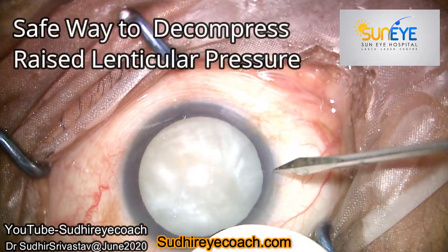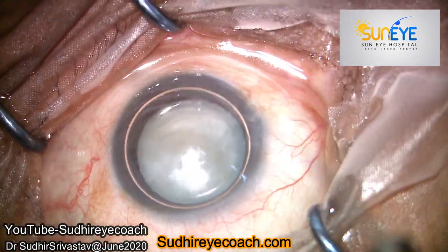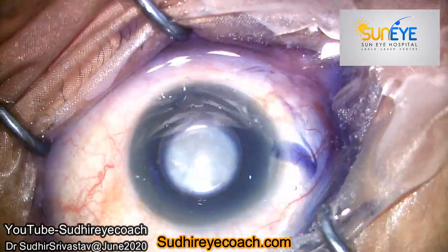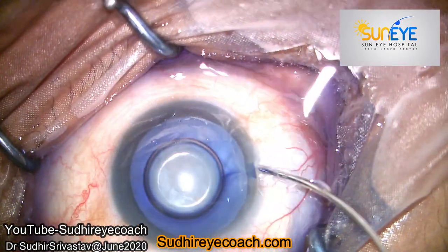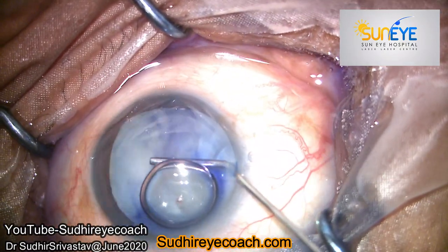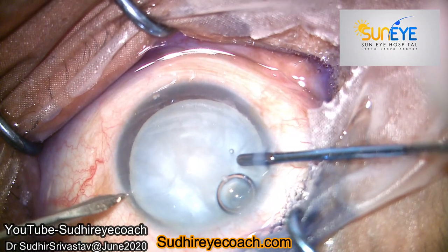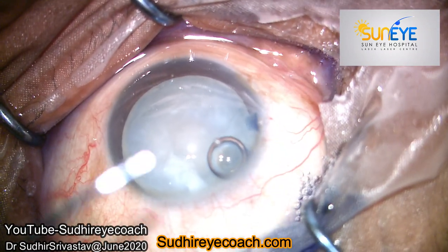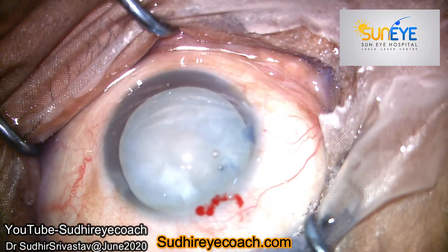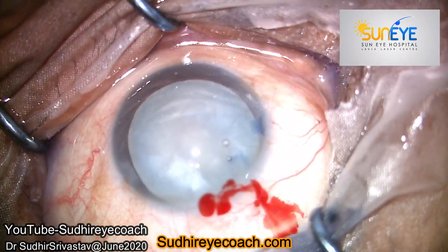Hello everyone. In my last video I showed a case where, despite my decompression of lenticular pressure, the small rhexis I made suddenly extended to the periphery. However, I managed it and completed my surgery without any major event. I got many good responses and feedback about the management tactics in such a swollen, intumescent cataract. After lockdown, we are suddenly getting a lot of mature cataracts. In this video I emphasize the way I decompress the raised intralenticular pressure.